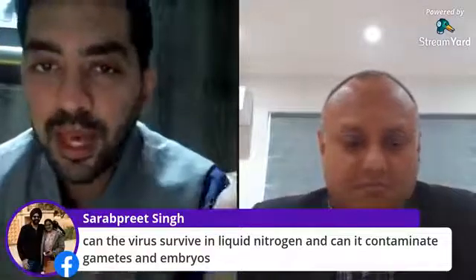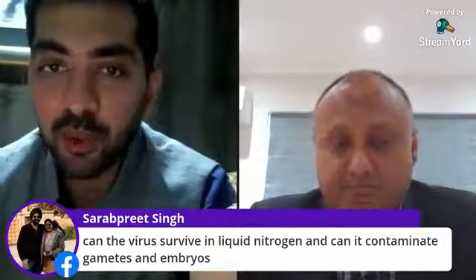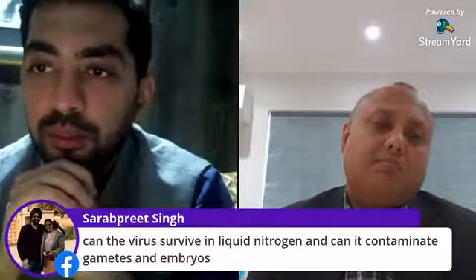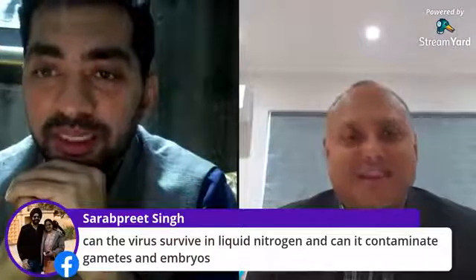Perfect. And even if you're not using a closed system, probably having a separate dedicated cryotank for such patients, especially for fertility preservation patients. I'm sure we're going to triage them, especially for the next 3 or 4 months at least, and only then start dealing with such cases. But even for the asymptomatic ones, if we are dedicating a tank for them, I don't know. It might increase the cost, but it's not far-fetched that we may have a second wave, and then what?